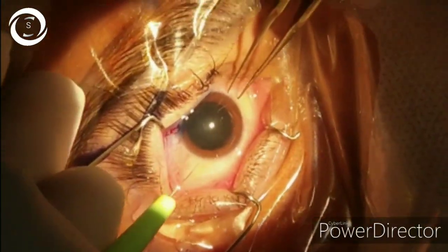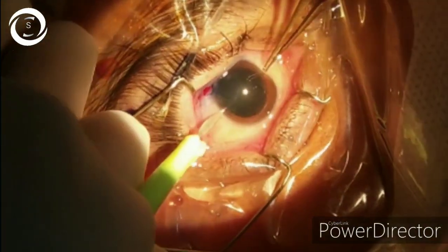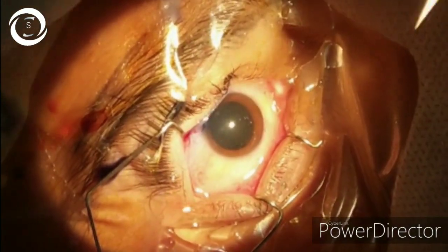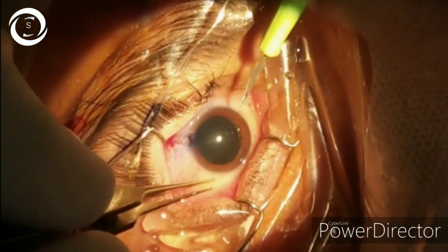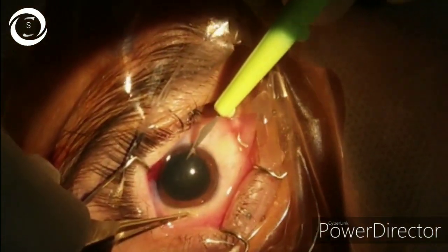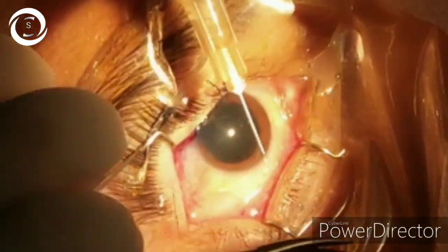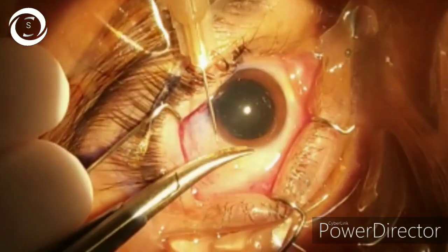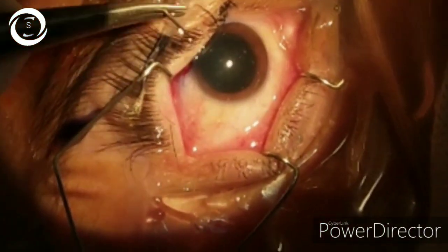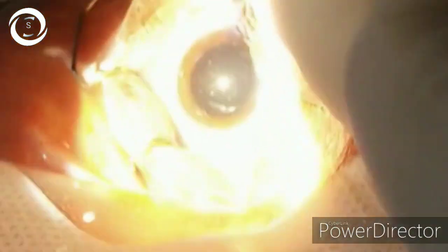I make two ports at 3 and 9 o'clock. The one on the right hand I use to do capsulorhexis, and the one on the left is a little bit enlarged and I use it for irrigation-aspiration. Now I am making the cystitome — you can see the bends are in the opposite direction — and we will proceed towards the capsulorhexis.